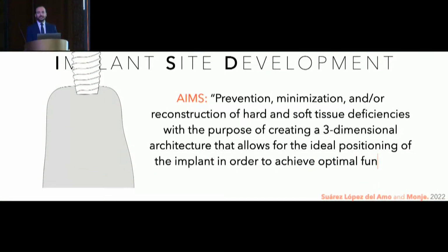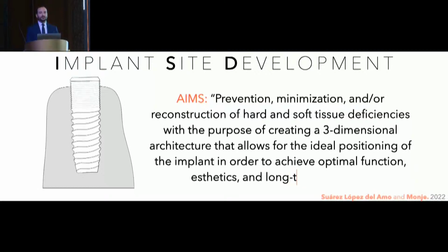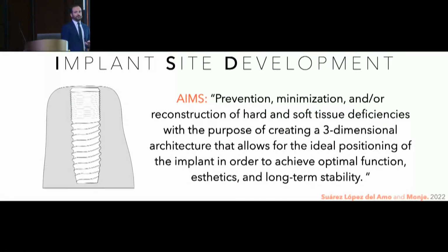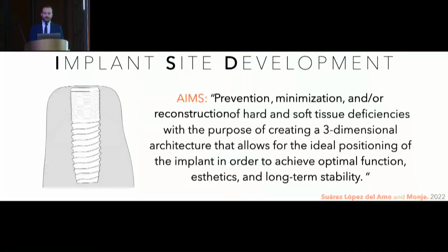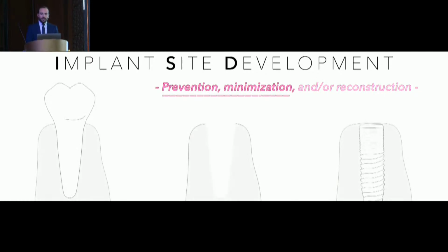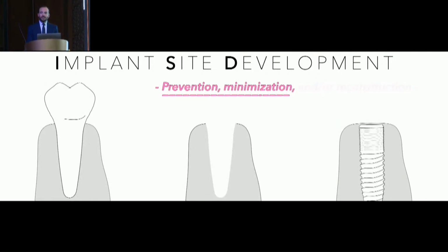And when we place this dental implant, we are not only looking at giving a restoration to our patients, we are looking for aesthetics, function, and long-term stability. Before I go deeper into the topic of guided bone regeneration, I would like to take a minute to talk about this definition. There is something very critical about these first three words: prevention, minimization, and/or reconstruction. What I wanted to tell you is very similar to what Rodrigo Neiva was talking about earlier this morning. It is about prevention.